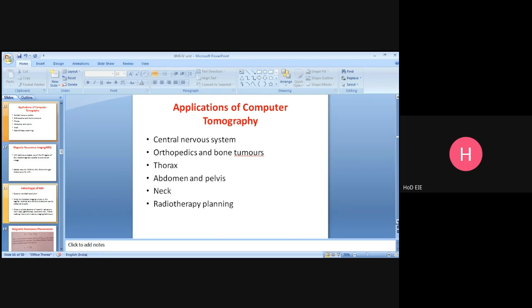Okay, and also if there are any serious lesions or malignant cells present, or in the differential diagnosis of pulmonary nodules, malignant or non-malignant, that is based upon the density variance present in the CT scan. It's very useful.